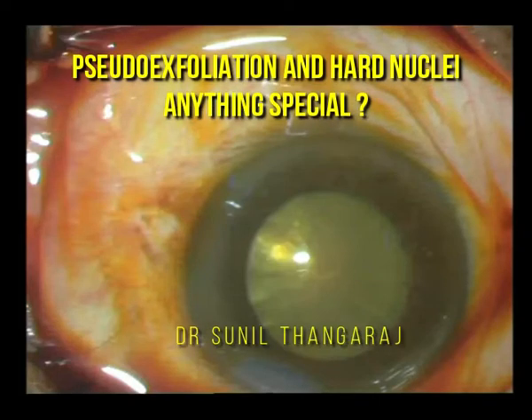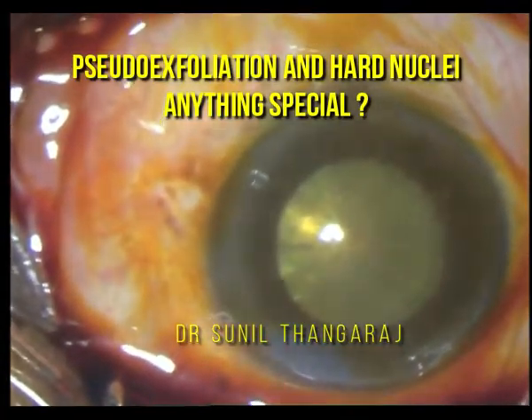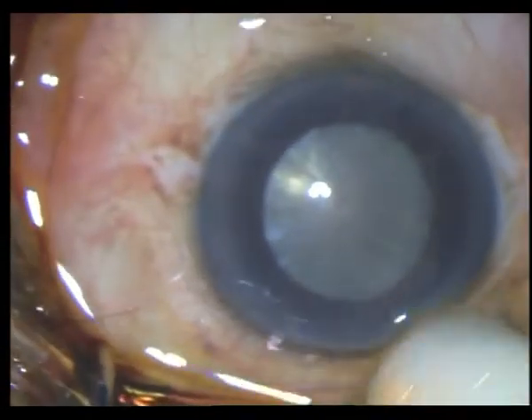This is a routine phacoemulsification done in a case of a mature cataract with a very hard nucleus and pseudoexfoliation.